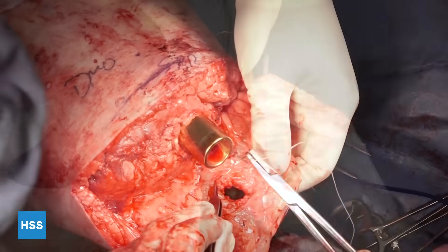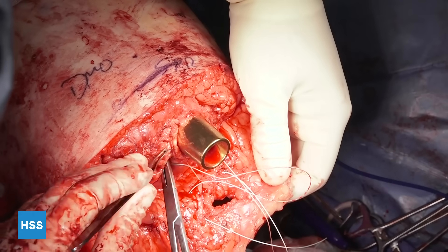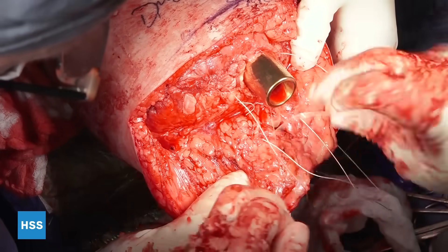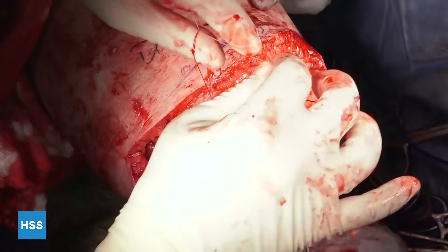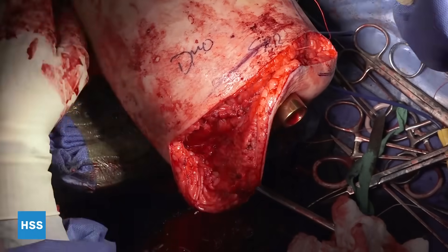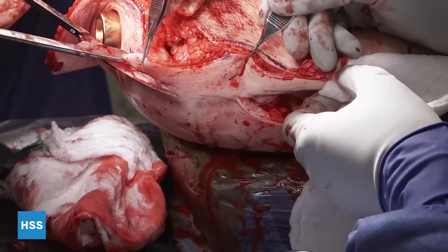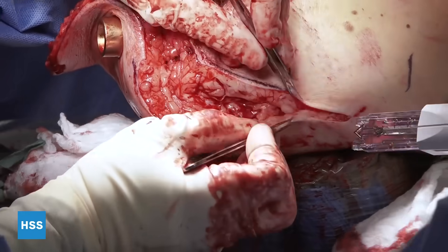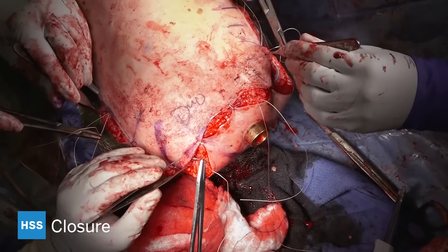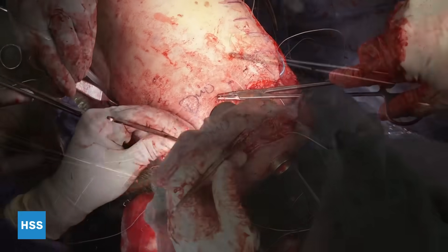The stoma has been created. These are quilting stitches — absorbable sutures placed to hold the flap in the optimal position and prevent sagging. You don't want sagging of the tissue. It's a nice lift and nip and tuck, so to speak. Using plastic surgery techniques, you can ideally contour the soft tissues so that there is optimal closure and optimal tension. Closure is typically performed with absorbable sutures.